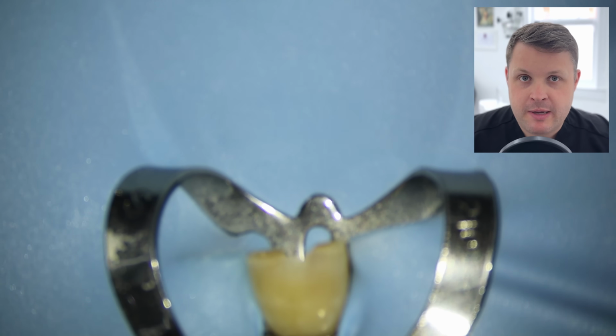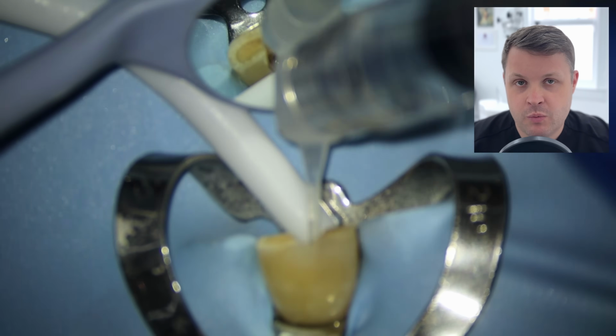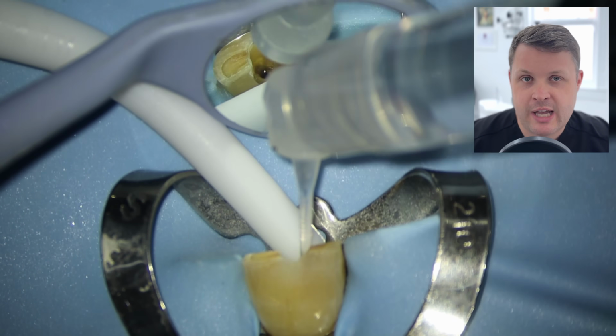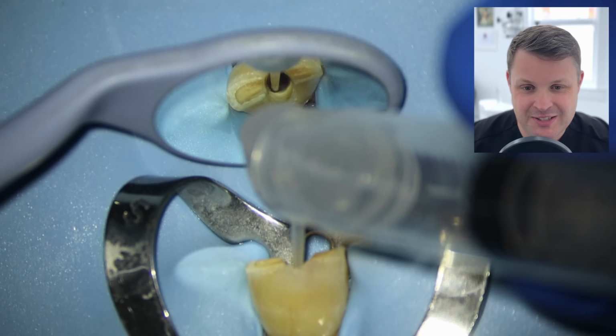So we're ready to obturate, but I obviously need to do my irrigation protocol. I've got to be really, really careful here, because obviously the perforation, I don't want to push any of the irrigants into the periapical tissues and cause a hypochlorite incident. You know, we've come a long, long way with this tooth, so I don't want to muck it up, and obviously don't want the patient to be in pain.